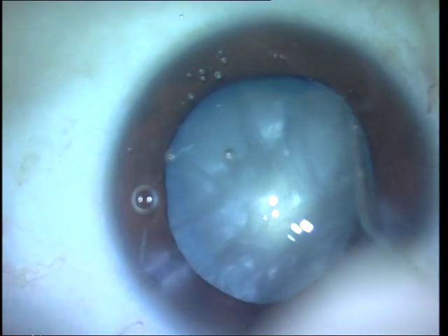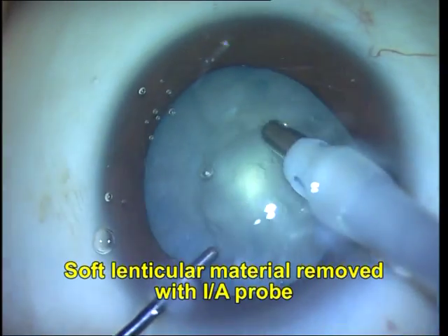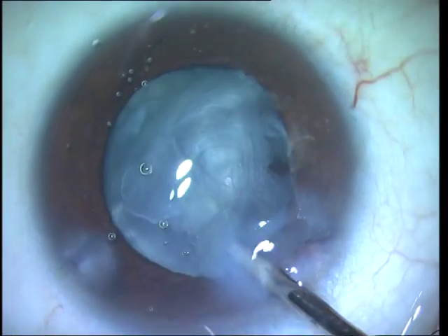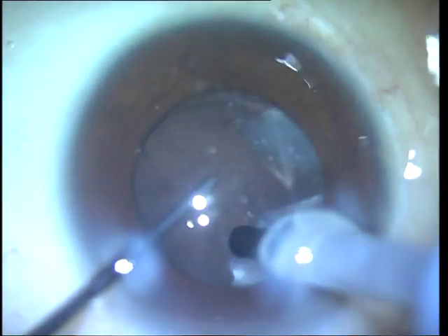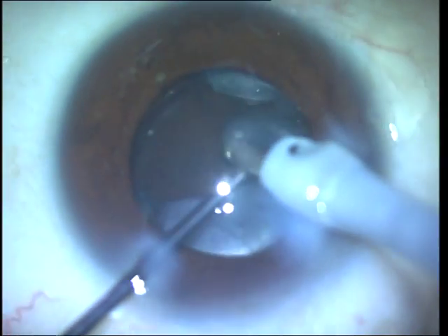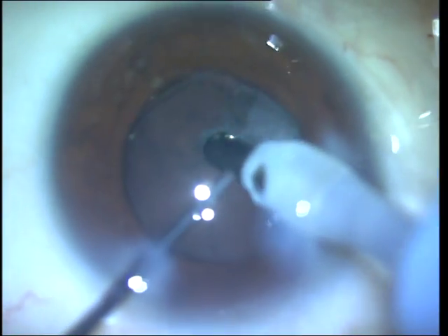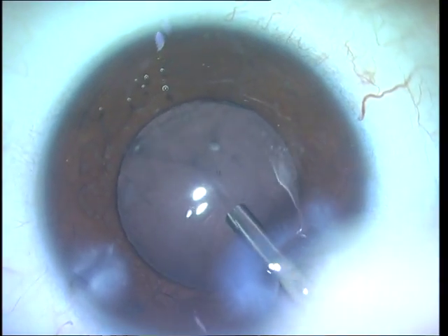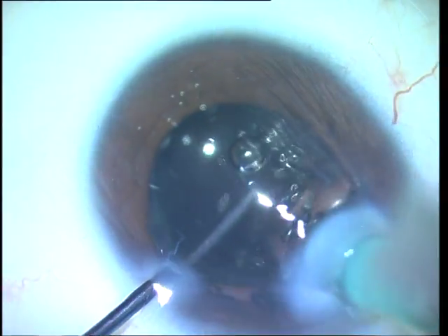Once I have completely cut off that tag there is a break in the rhexis and I have to be careful. I did a very gentle multi-quadrant focal hydrodissection without putting any pressure on the capsule, and once that is done you can see that the lens material is so soft that I removed it completely using only the IA probe. When doing cortex aspiration from the area where the capsule is broken, I left it for last and used lower vacuum settings when removing cortex in the area where the rhexis is not intact. The lens is finally implanted carefully into the bag.